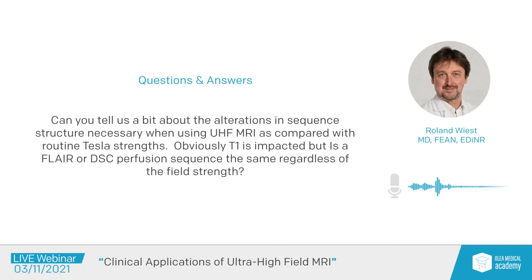And also for the FLAIR, I think you have seen that from the images. So the contrast, especially at the gray matter, is much lower than the one that you usually expect when we look at 3T images. So there are some risks or some cost factors, but they mainly are related in the clinical scenario that we use to the distortions at the borders, and they're mainly related to some signal drops and some signal inhomogeneities at the periphery. But for the majority of the questions that we try to address with this technology, we still do not struggle with these limitations.